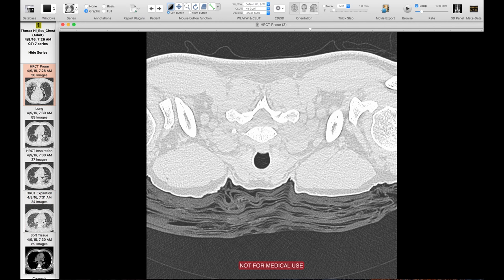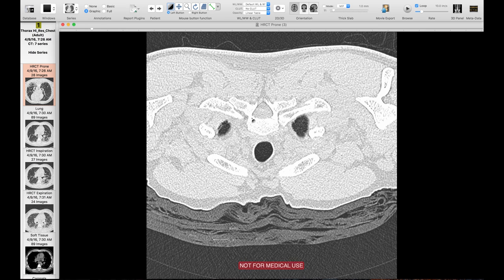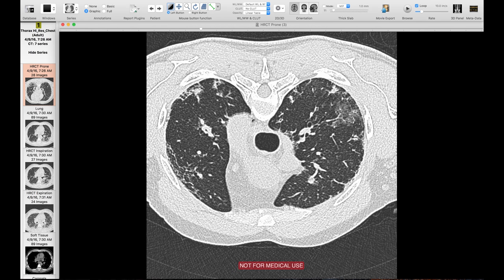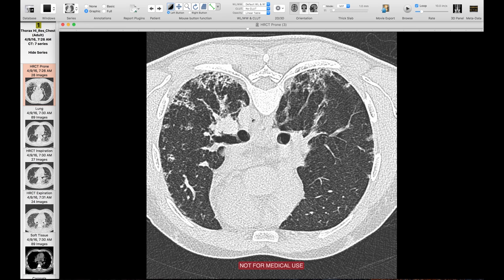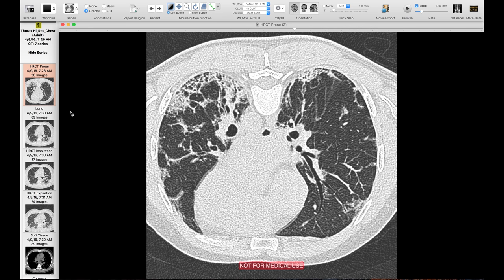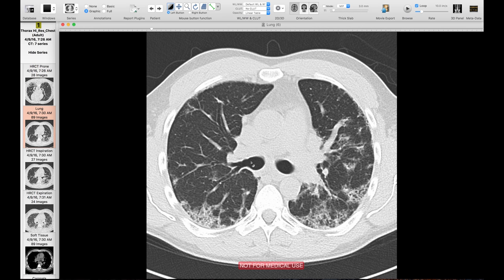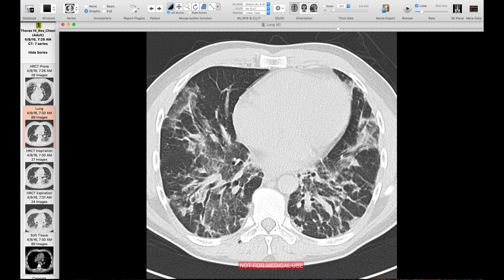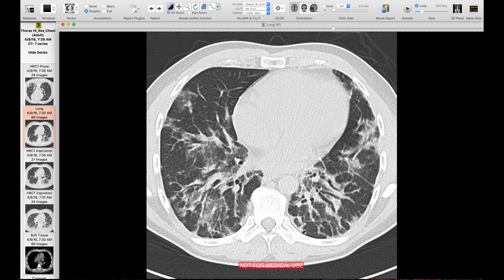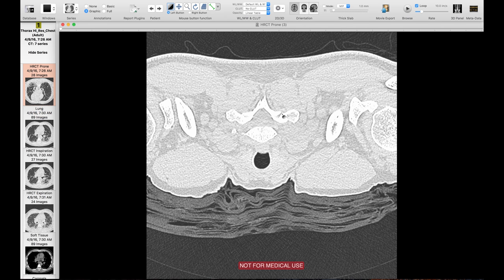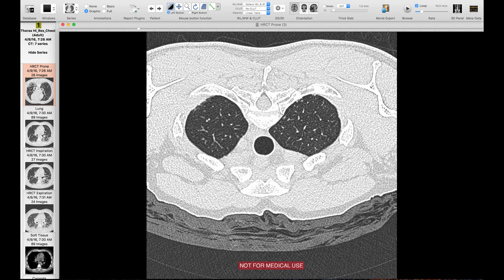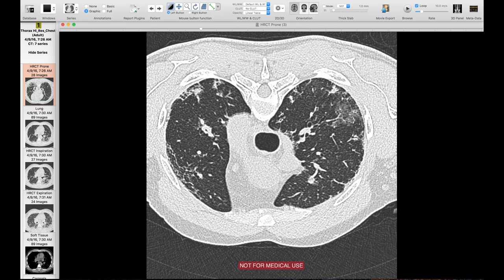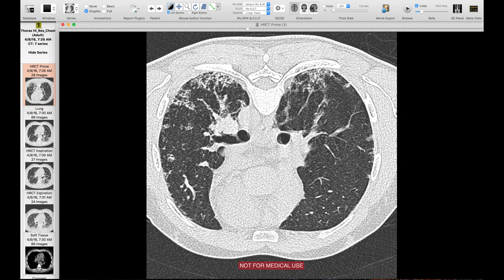Then there's the prone series. The purpose of the prone series is to ensure that what you're seeing on the supine series is real pathology and not just dependent atelectasis. Looking at the supine series, you might ask how you know whether findings represent real fibrosis versus dependent atelectasis. That's exactly what the prone series is for: dependent atelectasis will go away on the prone series, whereas real fibrosis will persist.